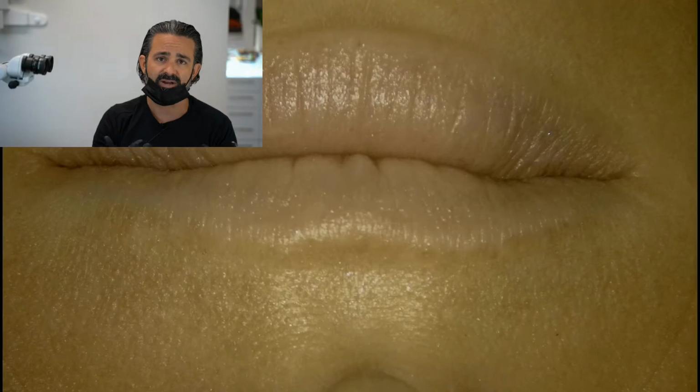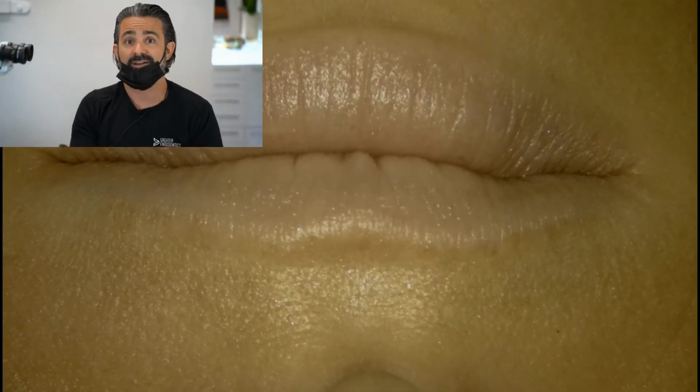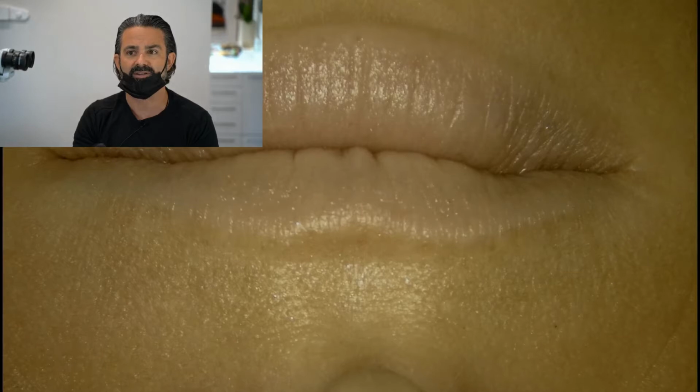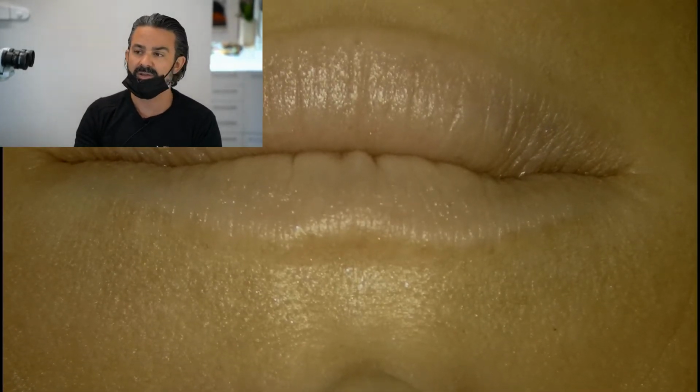It brings the contrast of the features between tooth, bone, ligament, granuloma. It just helps. It kind of gets a little bit weird when you're trying to do photorealistic photography, and so I won't use it that way.